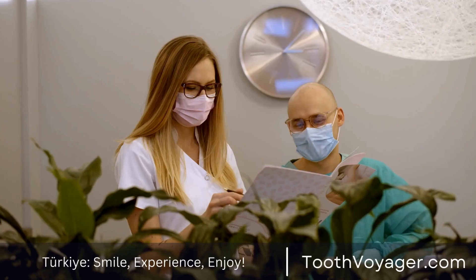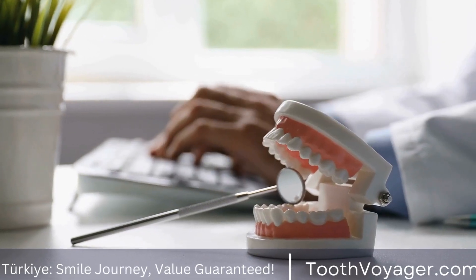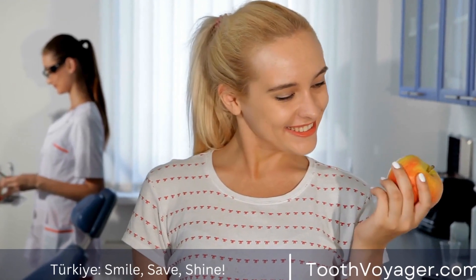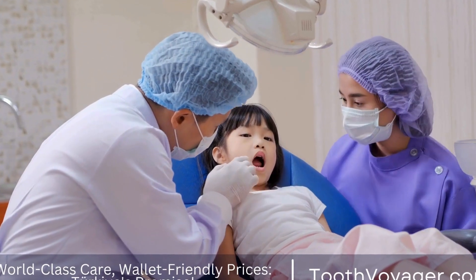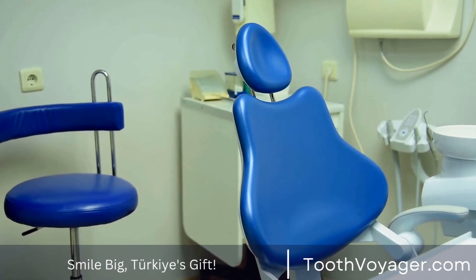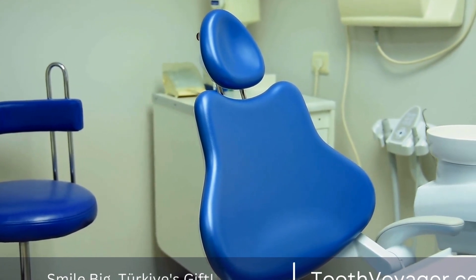5. Placement of the crown. The final step in the process is the placement of the crown. The tooth is cleaned and the crown is carefully positioned and bonded into place using dental cement. The dentist will ensure that the crown fits securely and comfortably, making any necessary adjustments to ensure a perfect fit. Once the crown is placed, the patient can enjoy a restored smile and improved dental function.